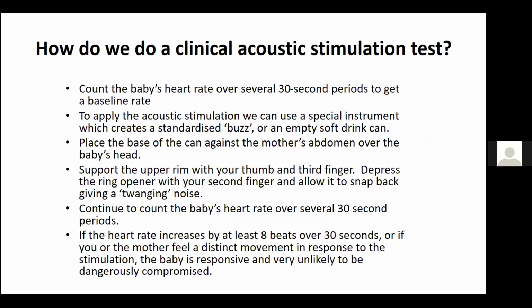But now what do you do? How do you deal with these flat CTGs? You will see a lot of them, but the instruction is very clear. Once you see a CTG that is flat, you do not stop the CTG in the first place. You need to continue with your trace for up to 90 minutes, right?